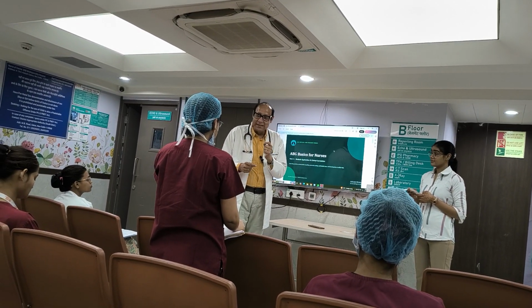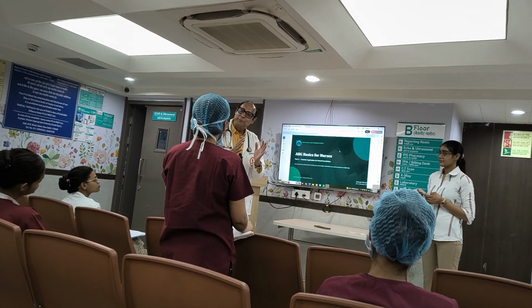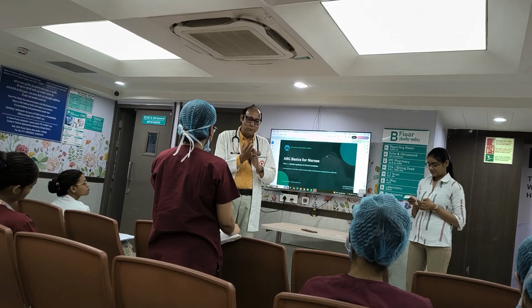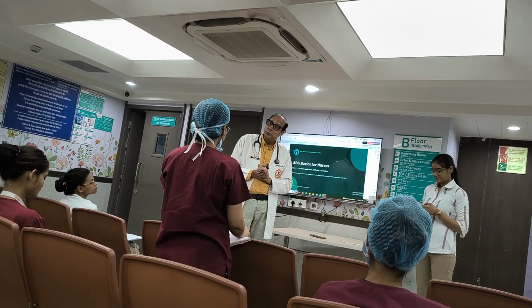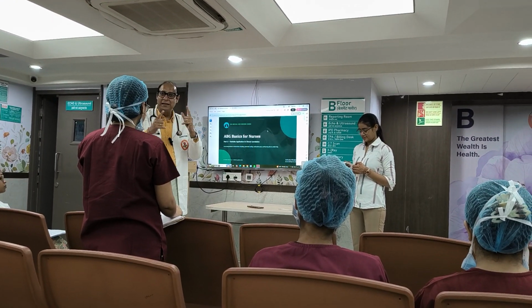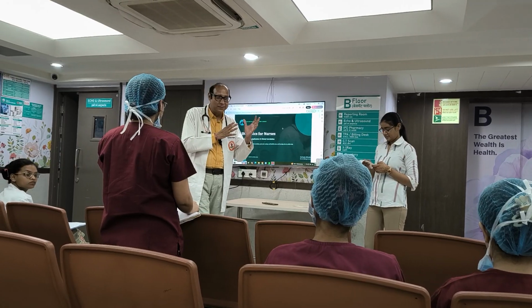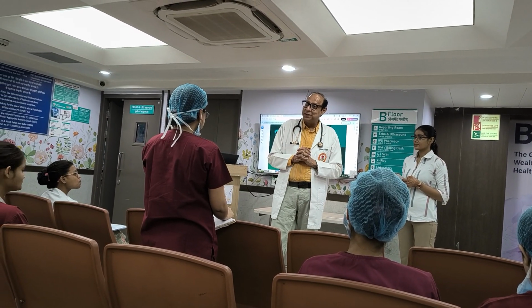If the patient is having some kind of pneumonia, any type of diffusion problem, pneumonia, ARDS, so your PO2 is going to be down. You got my point? SpO2, if hemoglobin is less or whatever, any kind of disease with a problem with hemoglobin, SpO2 is going to be decreased.